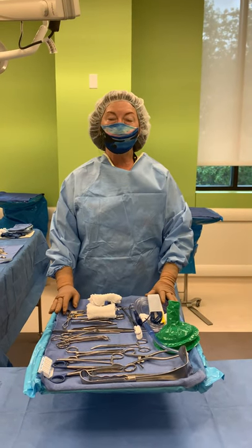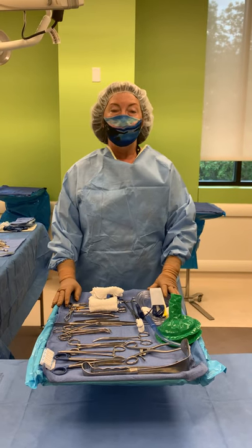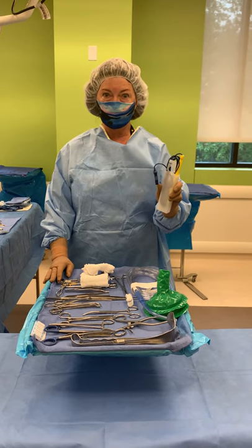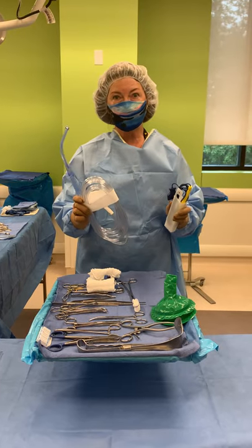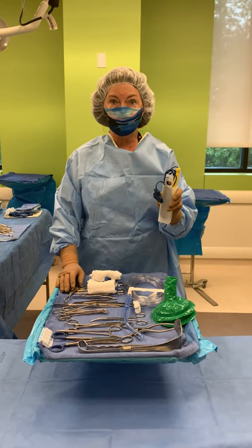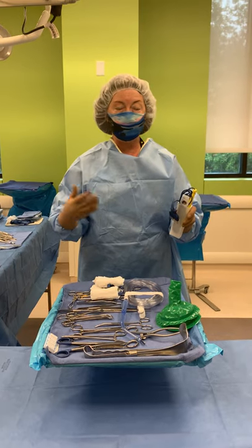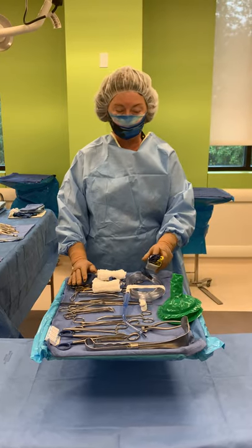Now we're going to demonstrate how to throw off your bovie and suction. Notice that I said it in the order in which you will pass it off. You first want to pass off your bovie cord because you're going to need the bovie in a case before you need the suction. We have to make an incision with a scalpel knife and then usually the bovie will follow, so this is the first thing you'll use. We won't have anything to suction until we make an incision and start boving, creating blood and body fluids coming up to the surface.